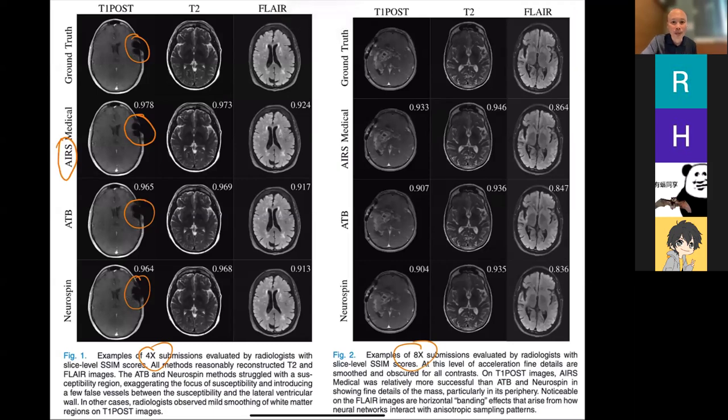Okay, the question is, where does the random sampling relate to the sparse transform? The random sampling is just to create an incoherent pattern so that the aliasing is incoherent. Then, if the aliasing is incoherent, in the transform it will tend to go into the smaller components that can then be thresholded out. Okay, it's a good question.